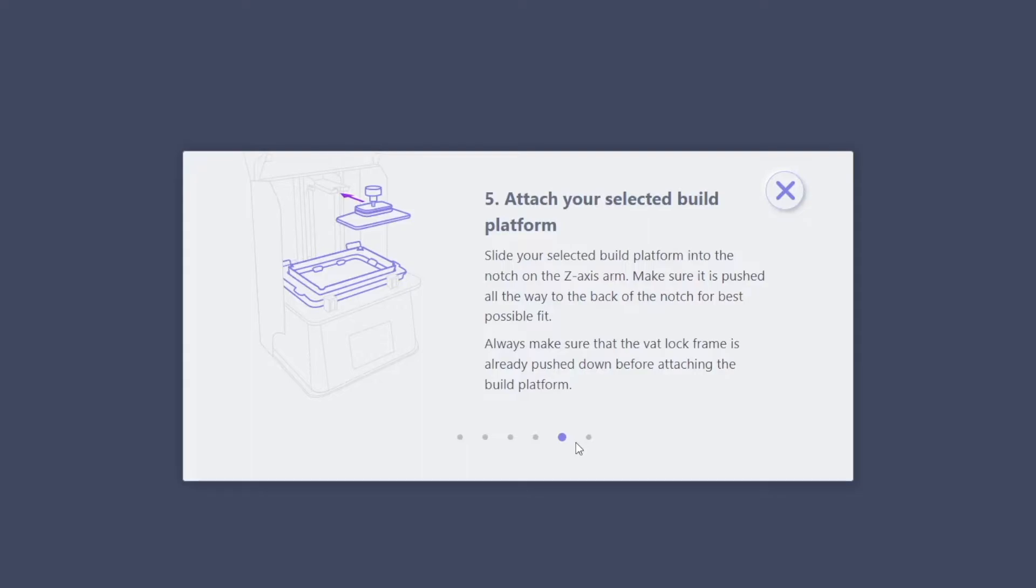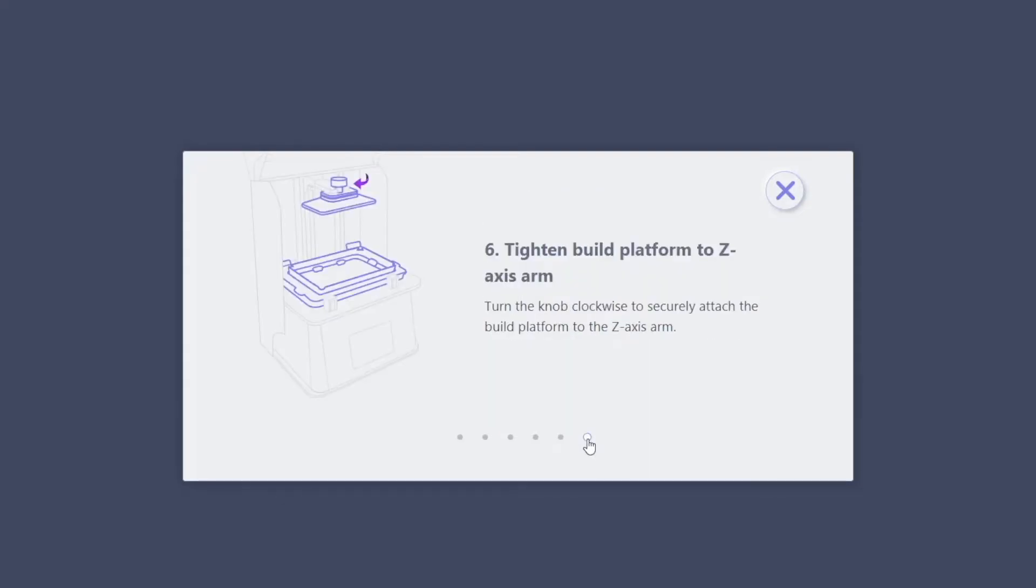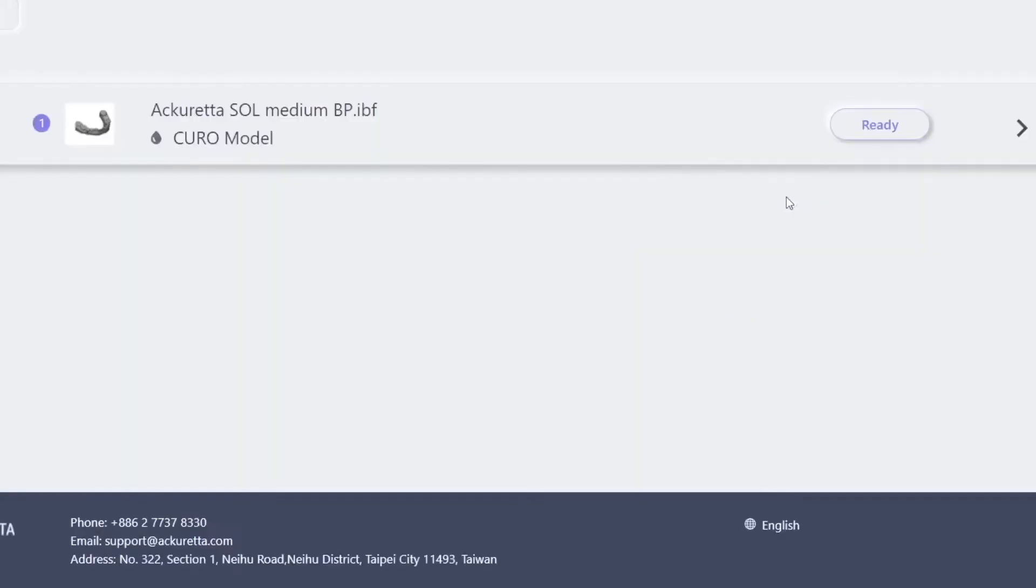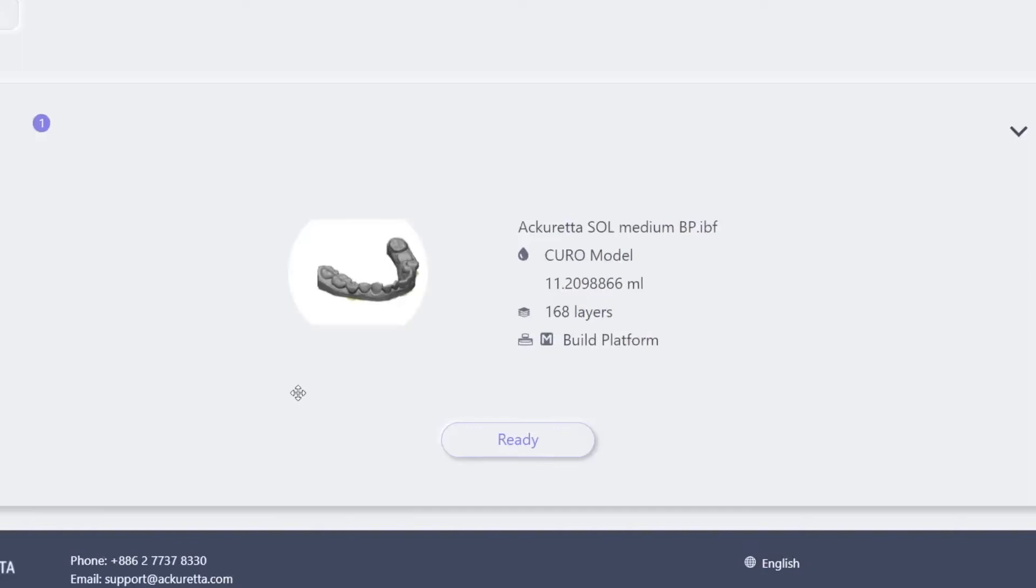Before you start your print, you will see on your printer's browser screen which build platform you have selected to print with. The process is the same for the small build platform.